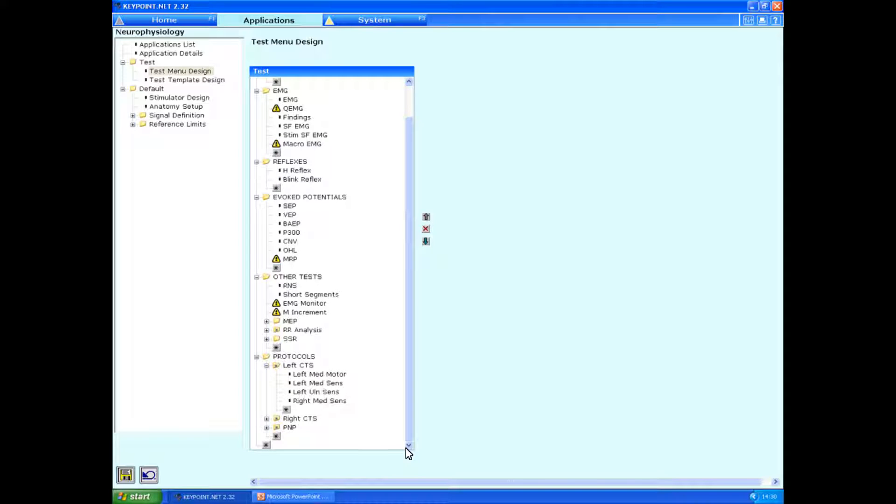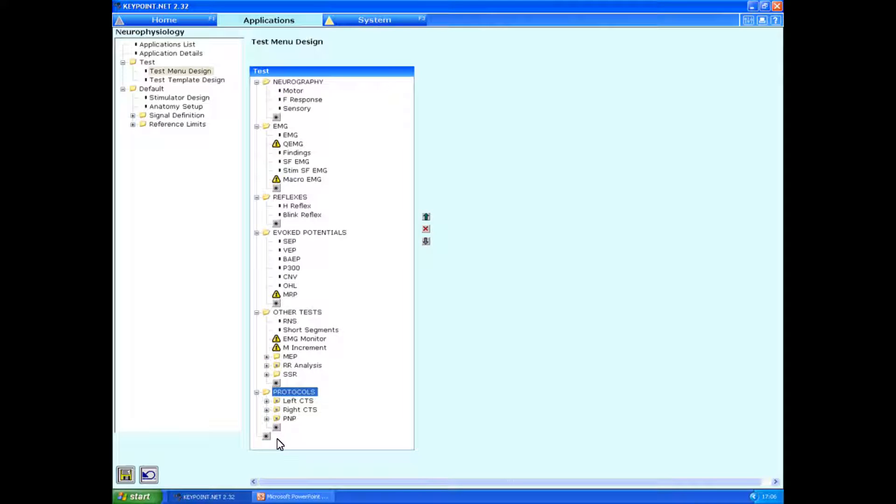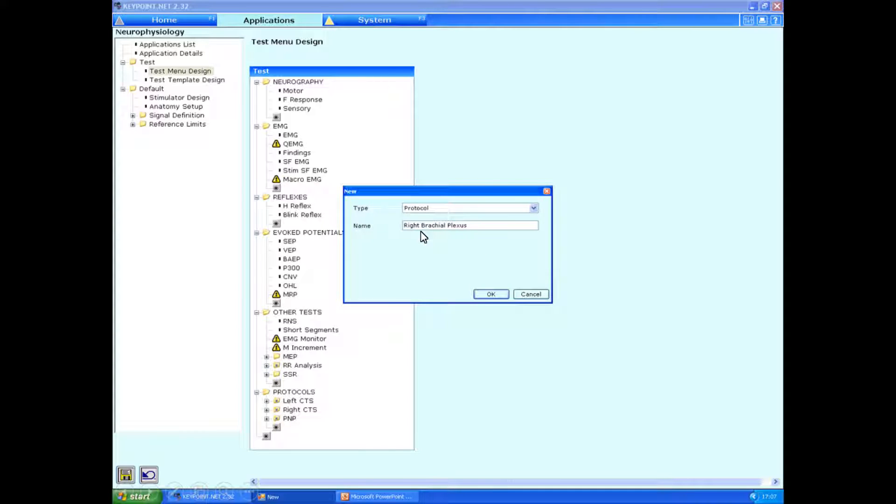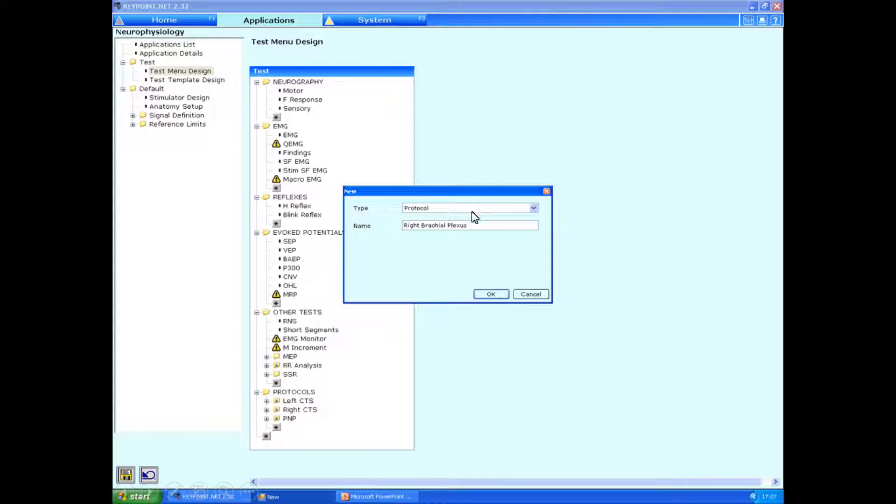Coming back to our menu design, we're going to click on the small little star over here to add a new protocol. And what I'm going to do is bring up this little box which says new. In it, we choose protocol. And in this example, I'm going to show you how to set up a brachial plexus protocol. And this will be for the right hand side. So I've just typed in the name right brachial plexus and we'll click OK.